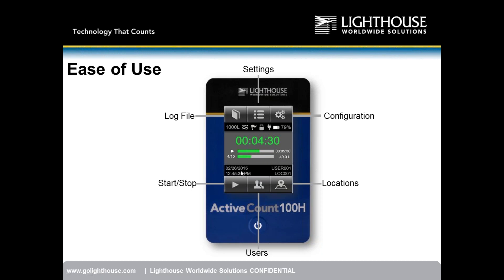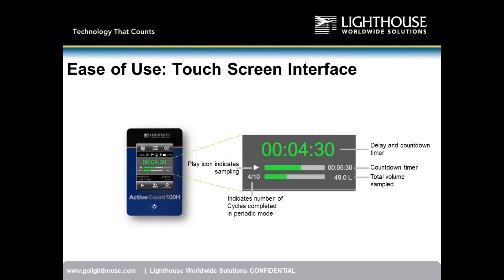These two bars grow as you continuously sample. You have a date, time, user, and location name displayed. This interface is so simple you can train someone how to use it within 10 minutes. There's a countdown timer, a delay timer, a status bar, the number of cycles completed in periodic mode, and total volume sampled so far.